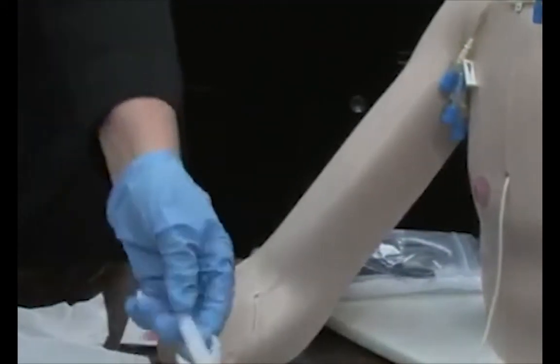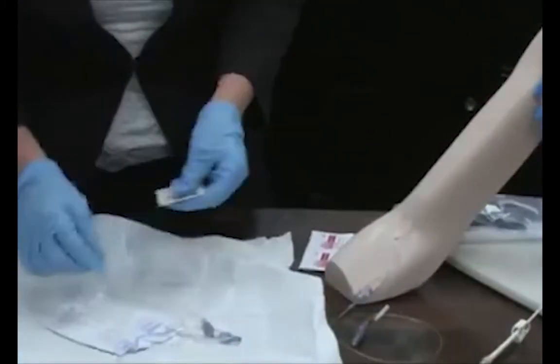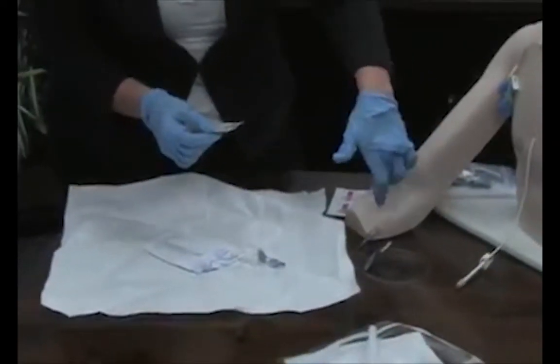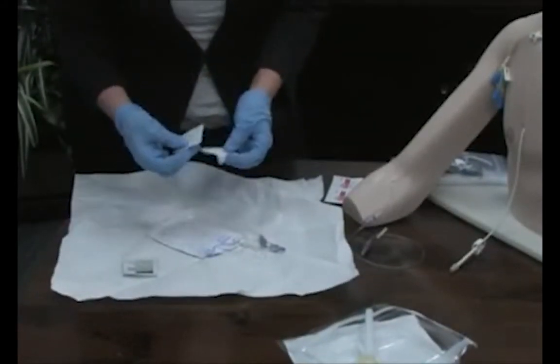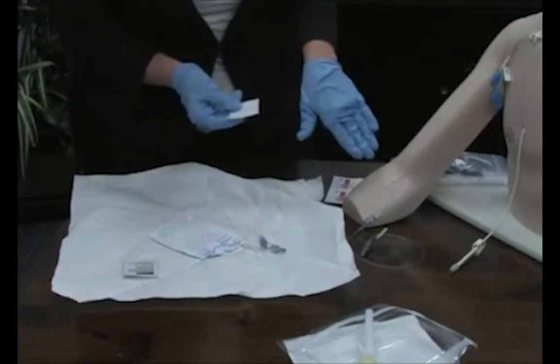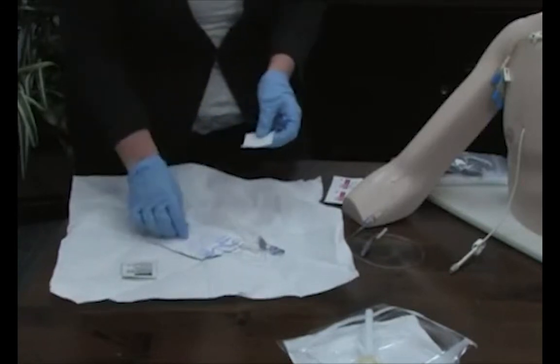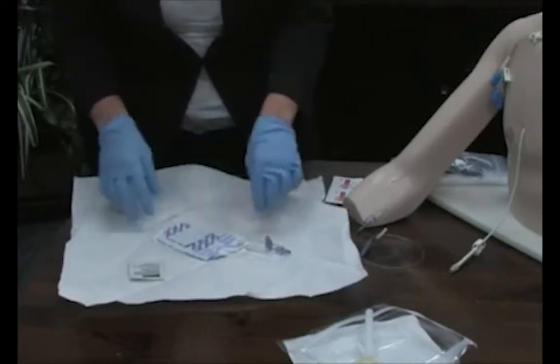And this is what I would put in my little trash bin there. We provide you with skin prep that can be used around the area once the chlorhexidine dries. And it's important to remember that a gauze and tape dressing at this point on either one of these catheters, if you put gauze underneath the dressing, it is then considered a gauze and tape dressing and must be changed every 48 hours according to INS. So unless you absolutely need it, do not use the gauze.